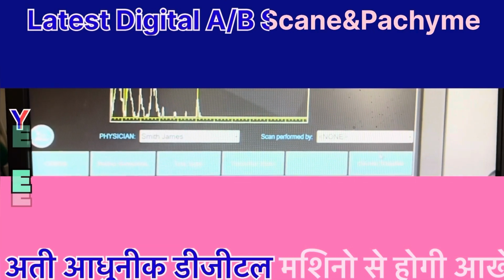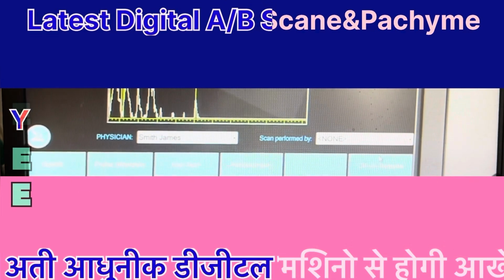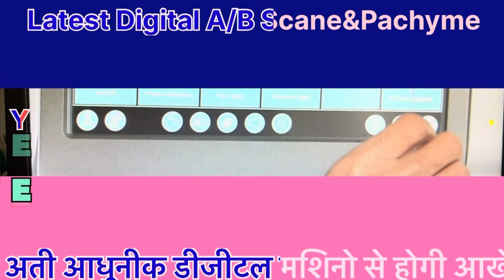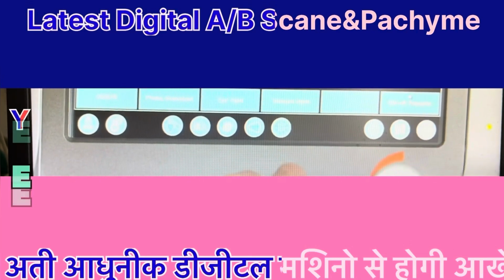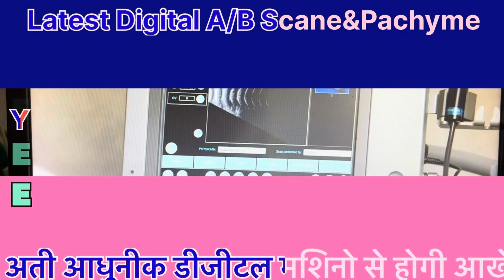For B-mode guided biometry performed with the 10 MHz B-scan probe, the position of the cross-vector CV line can be adjusted by left-clicking and moving with the mouse, or by changing the value in the CV field.